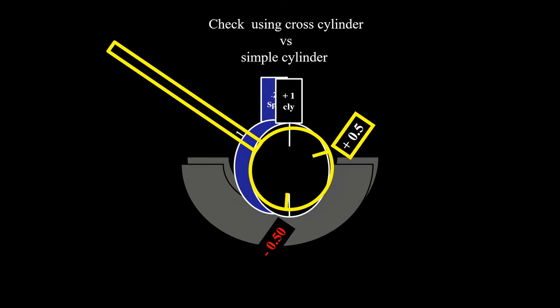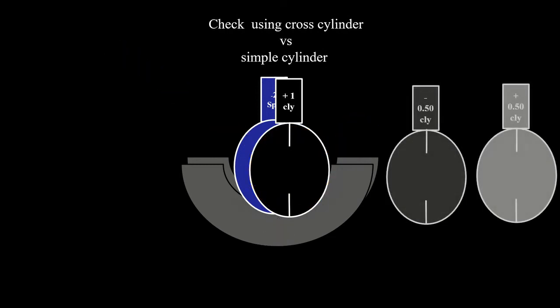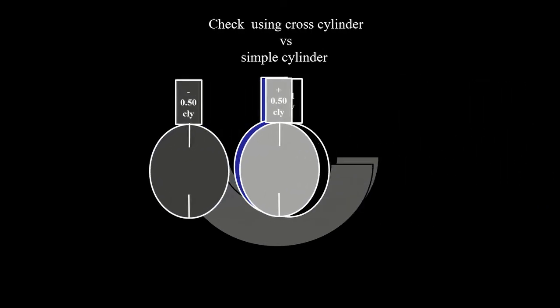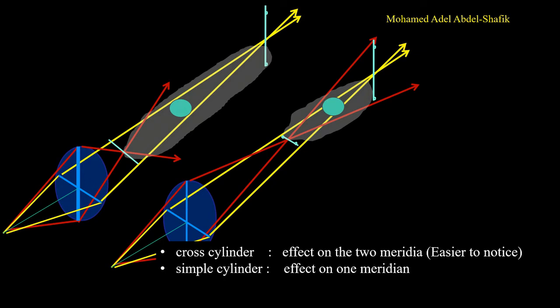While if we get a cylinder from the trial case, we can add one or decrease the other. Simply, you are affecting one meridian and not the other one. So in the case of the cross cylinder, as the effect is on the two meridia, the conoid of Sturm will be nicely noticed by the patient as being worse or good, as being long or small. In the case of just using a simple cylinder from the trial case, the effect is only on one meridian. So the cross cylinder gives the patient a better chance to notice the difference.